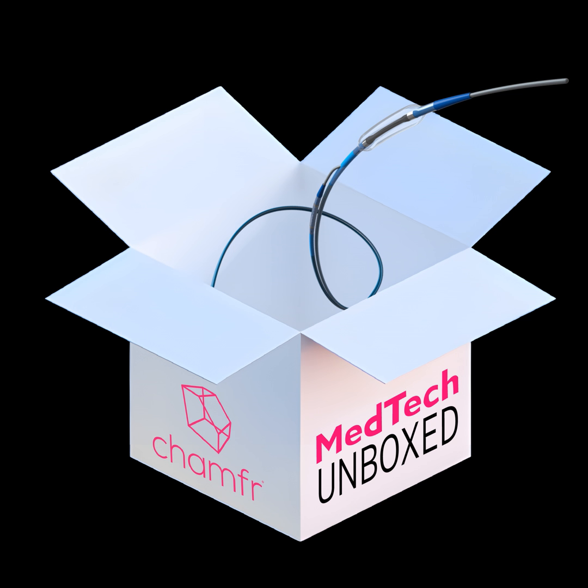If anyone listening right now wants to try it out, the latest version we just saw, I just uploaded it to my website, which is VirtuCath's.com. You can find the beta download there. And this is probably the last best chance to try it out. I'm hoping to release soon. The design's not finished, so if you want a feature that will be the killer feature for you and you want to add it now, please try it out. Send me an email. I'm open to adding more features now before I lock it down and release it.